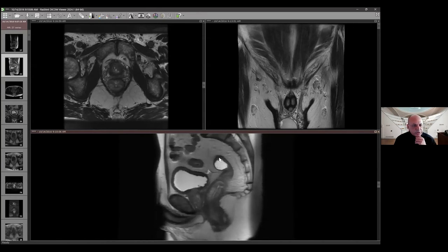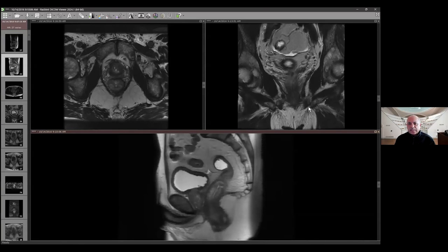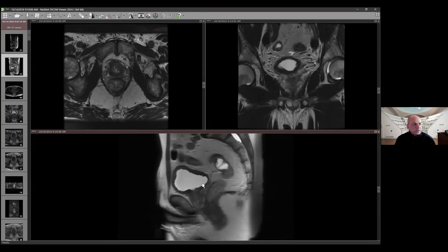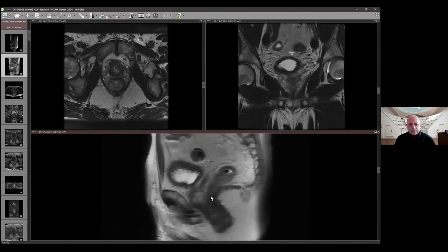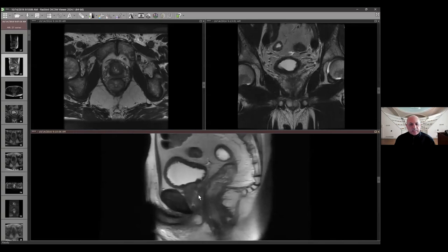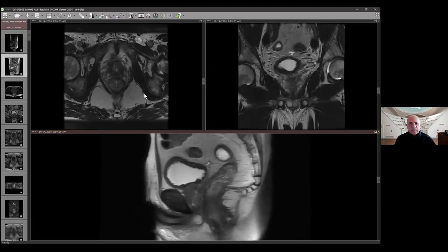This protocol was not done at our institution. Some institutions do one plane as a single-shot fast spin echo instead of all three planes as a classic turbo spin echo. The reason we don't like that is because the contrast-to-noise is blunted — it's not as good as on the axial and coronal. Despite its speed and relative lack of motion, the contrast-to-noise is not as good. With current deep learning-based sequences, our entire prostate protocol including dynamic enhancement is only about 15 minutes, so there is really no need to dilute the protocol.